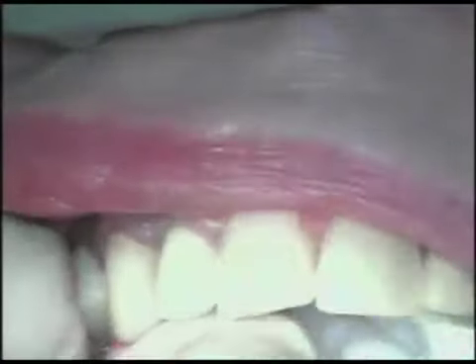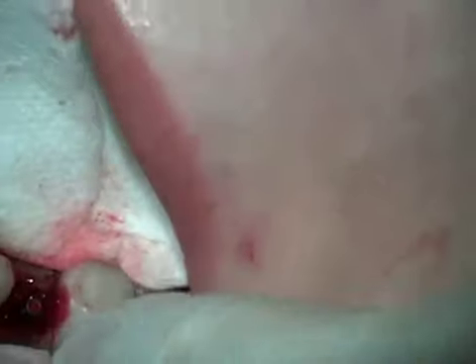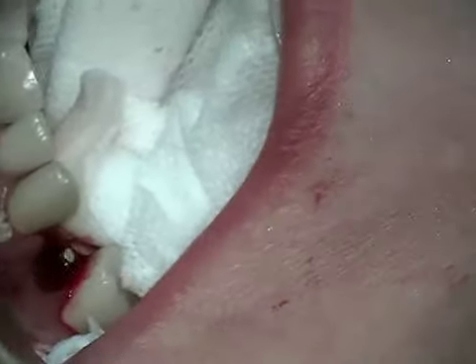perio probe again, so that we can cement this on. We don't want it to come off, because if it gets loose, you have movement of the provisional crown, then that's going to irritate the tissues, and you'll get inflammation of the soft tissues around the implant, and that could eventually possibly lead to failure of the implant. So that's why we use the temporary cement, even though it fits so well, because we don't want to have any movement at all.